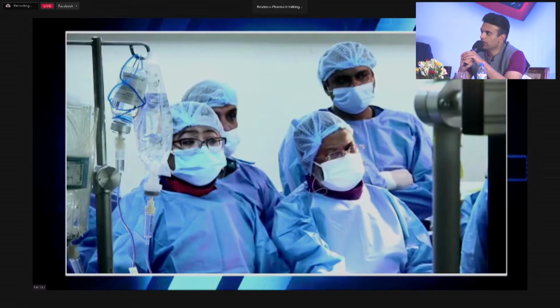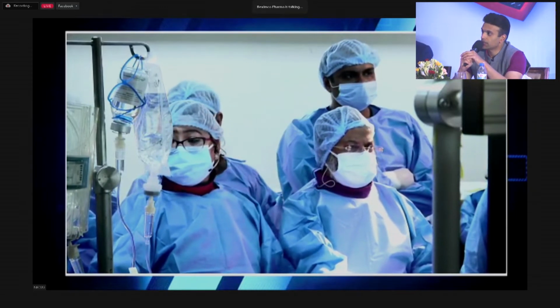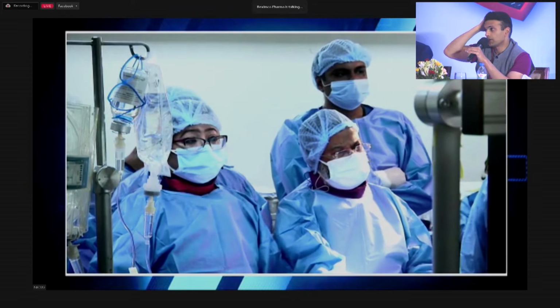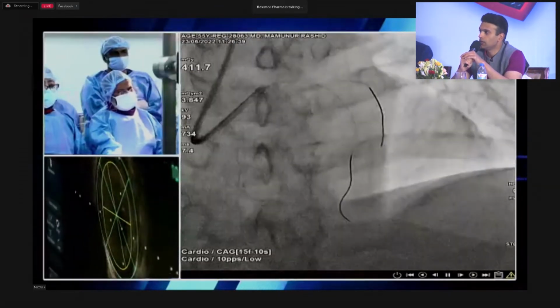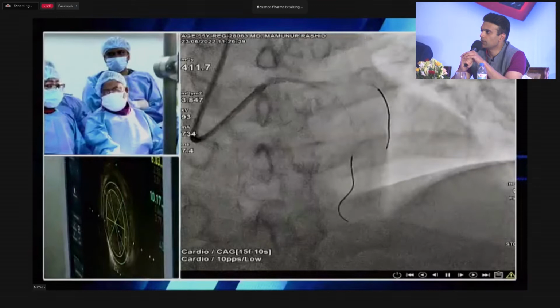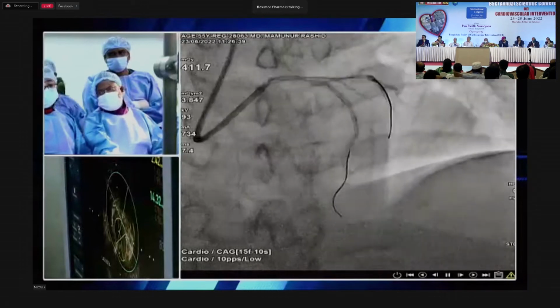That indicates either a high lipidic core or a necrotic core of a lesion, which gives you a risk for distal embolization of material. That's the one thing that's worthwhile recognizing about this case: your stent is going to have to come back from the LAD back to the left main with 1:1 EEL to EEL sizing, but you should be ready in case you have some distal embolization of some lipidic or thrombotic material located behind that plaque, given the amount of dropout on the IVUS.